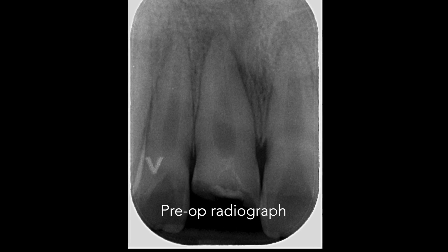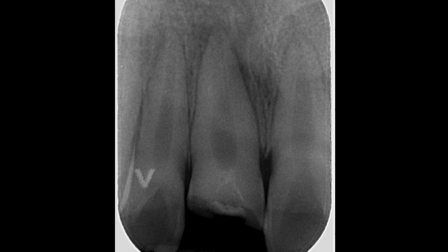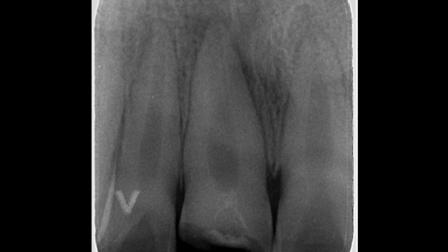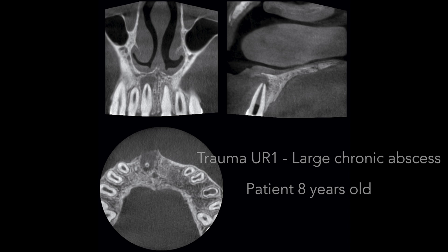Here you can see the preoperative radiograph of the maxillary right central incisor that had a complicated crown fracture. A small volume CBCT was exposed to check for root fractures. You can see a large chronic periapical abscess.